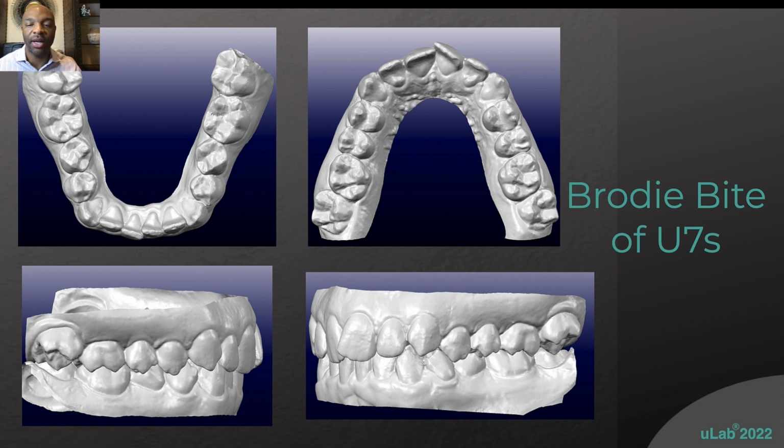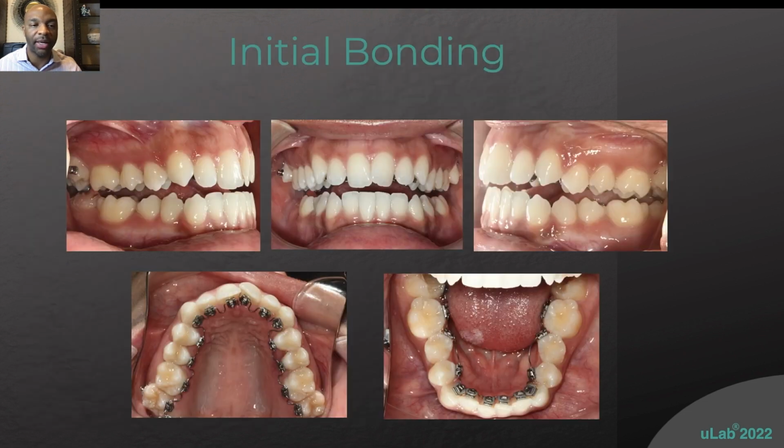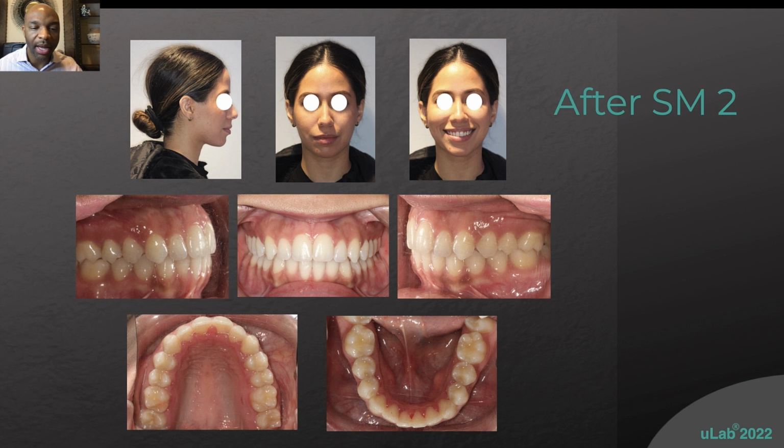And this is just a picture showing the full crossbite that she had with those upper sevens and the overlap and the crowding that she had. And so again, we did lingual braces with Embrace, and we were able to do some cross elastics to get everything into occlusion like we needed to. And this is where she finished.